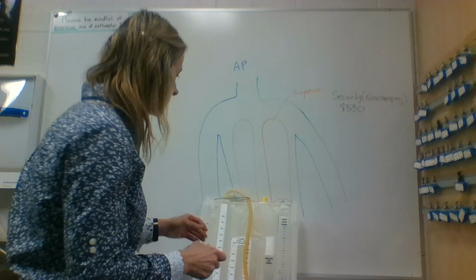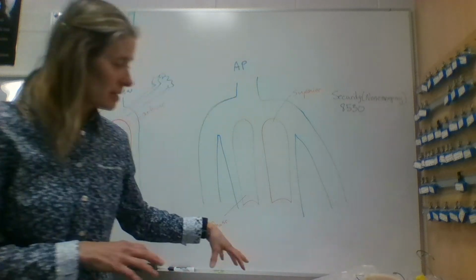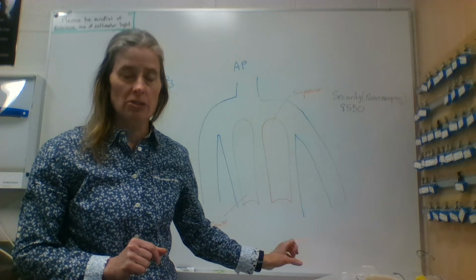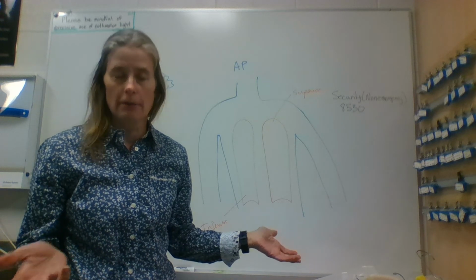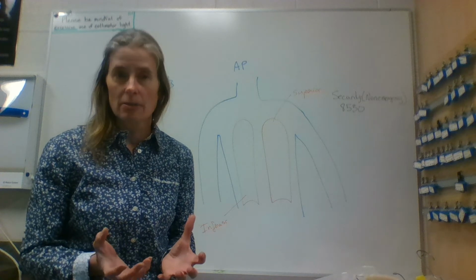What happens here is we need to understand that when these patients come down, we shouldn't hear any hissing or any sounds from this closed chest tube drainage system. If you hear something like a bicycle tire, if you start to hear air, something's not right. There's something wrong with one of the connection pieces. It is no longer a sealed system.